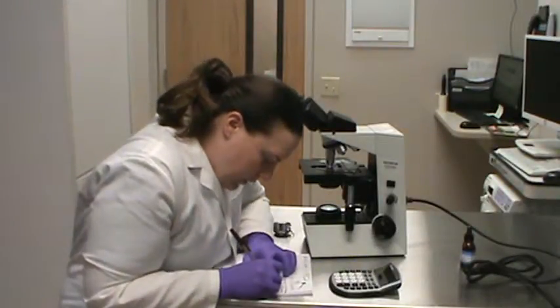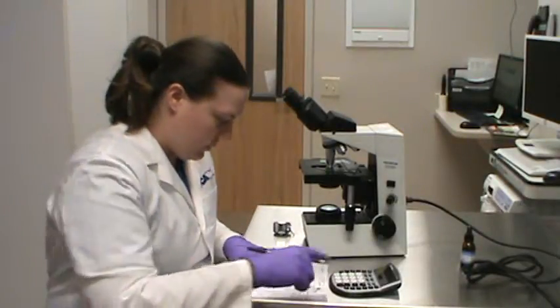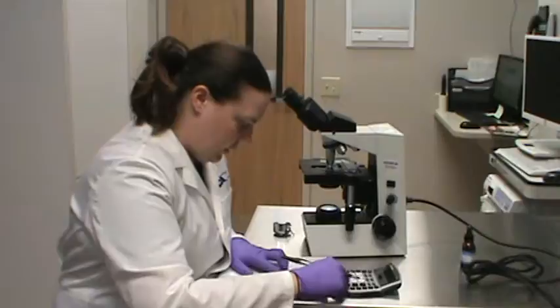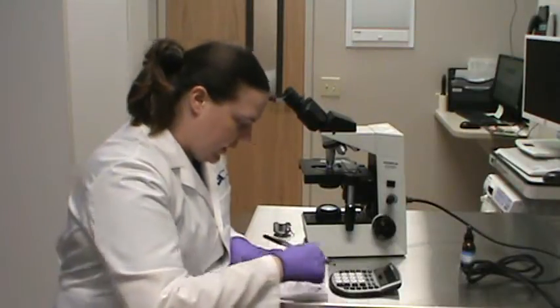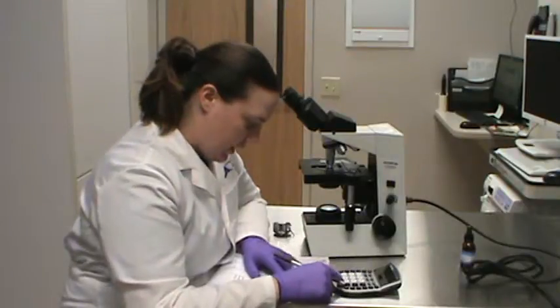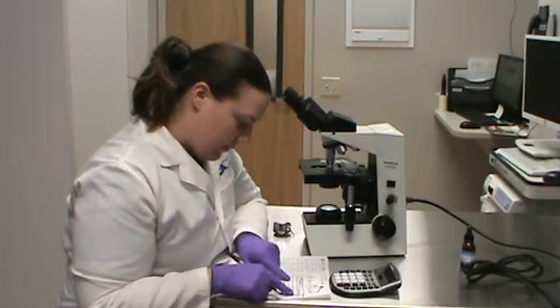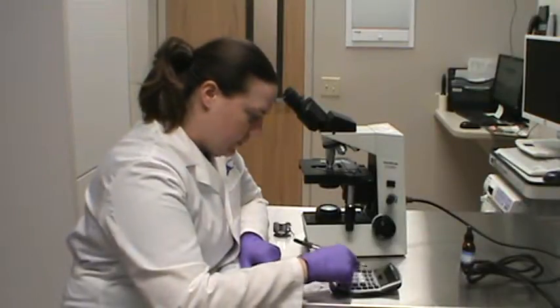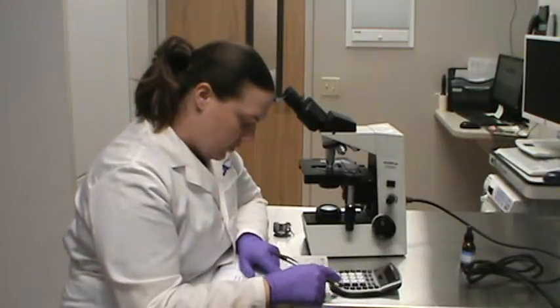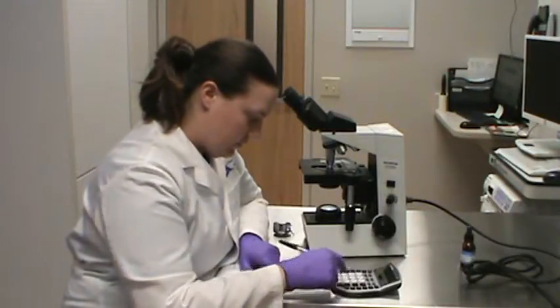Okay. So it adds up. For neutrophils, I counted 85, which is 85%. And band neutrophils, I have 5, so that's 5%.